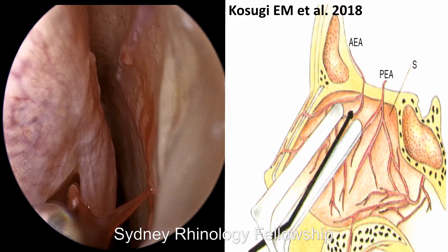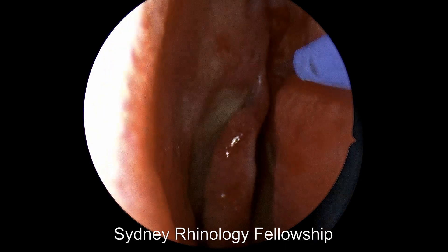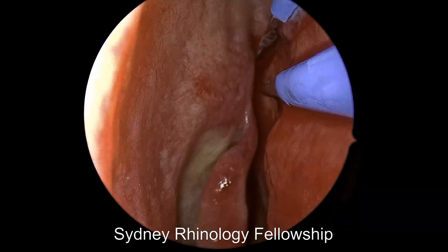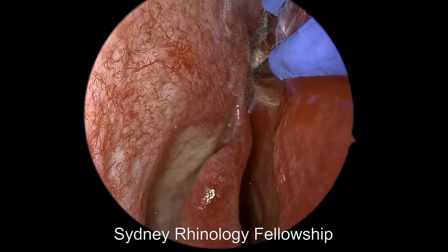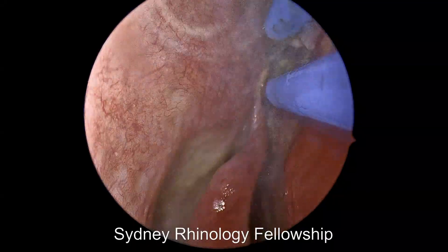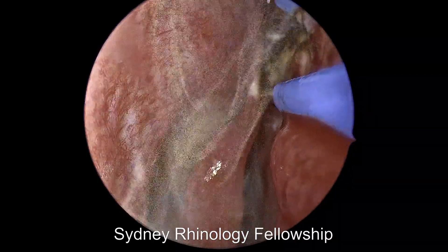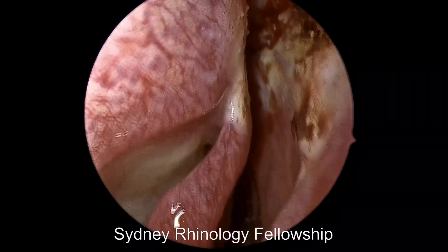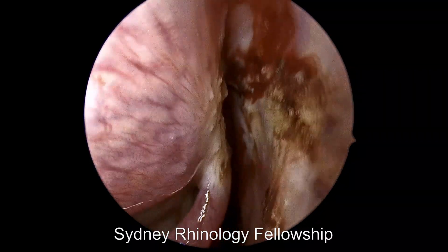It's branches of the anterethmoidal artery. Here's a patient who's been bleeding regularly from their nose, and actually it's not their septum that's bleeding down low and anterior from Little's area, but the anterethmoidal artery vessel area, often referred to as the S-point. This is a very important spot to go looking for when you have a patient with recurrent epistaxis. It's well deep in the nose. Some simple gel here will allow that to heal.